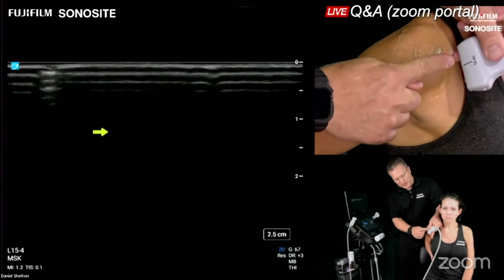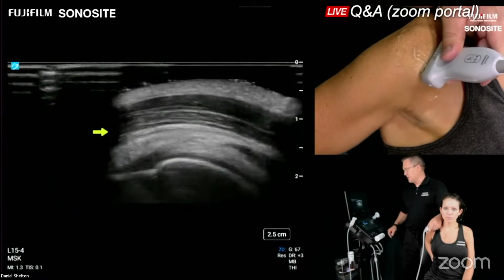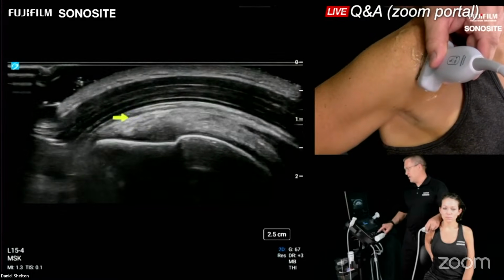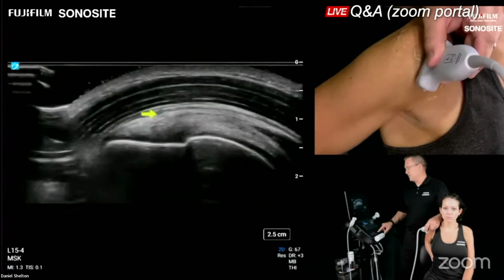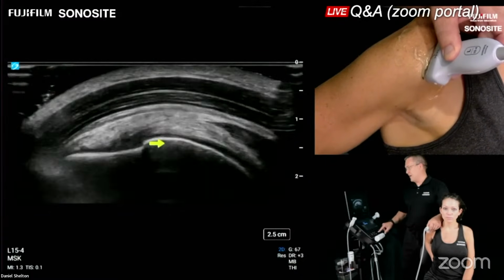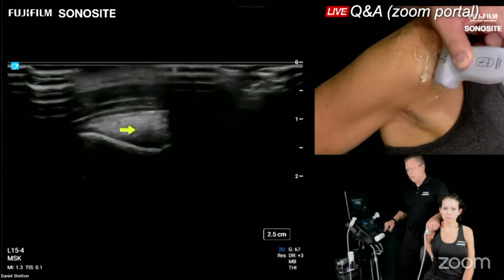And then I'm laying my finger down underneath the transducer surface to act as a stilt, so that I can lay the probe into the gel first and get this really pretty view of the supraspinatus without compression. So see how the deltoid is not compressed, the subacromial subdeltoid bursa is not compressed, and if I had any suspicion of any tears here, I would not be collapsing that useful pathology either. So just a little scanning tip that you can pick up here and there. That one has helped me a lot along the way.